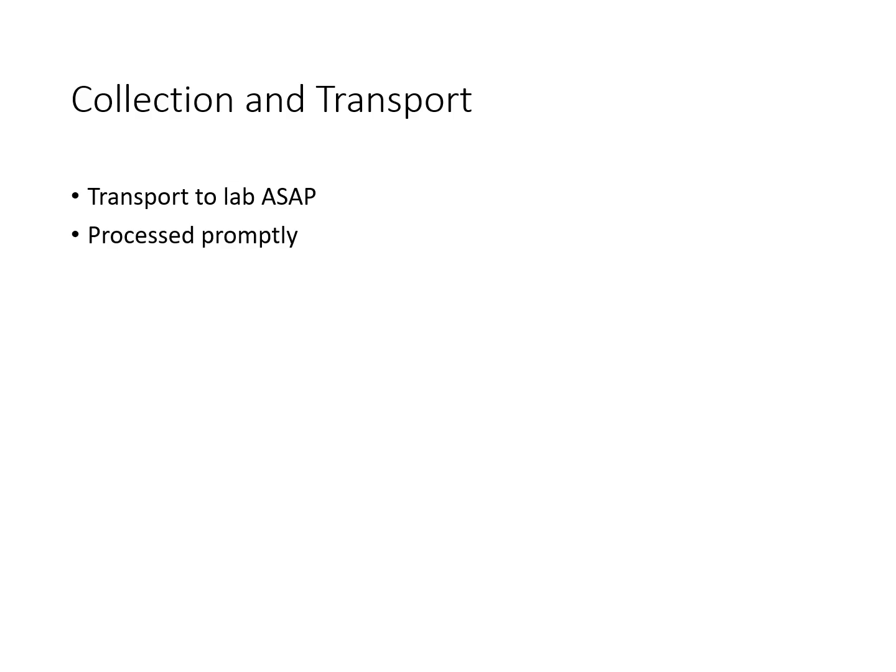For collection guidelines, we're going to use sterile tools to collect the fungal samples and collect sufficient material, including parts with active growth or infection. We're going to try to avoid contamination with soil, debris, or other microorganisms. And then it's going to be transported to the laboratory.